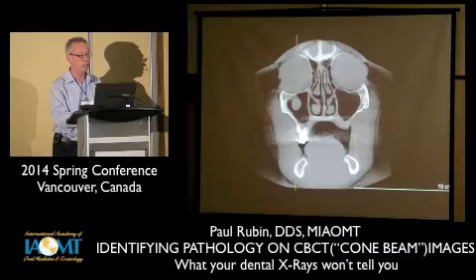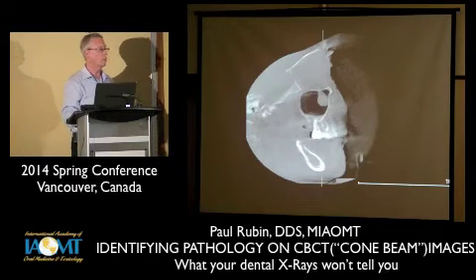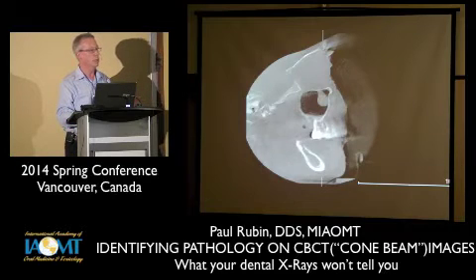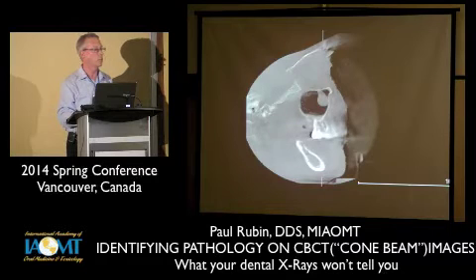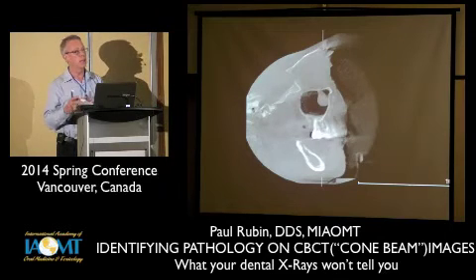Here's that same sinus polyp on the 2 other views, the coronal view and the sagittal view. And on this software, you can capture this screenshot, email this off to an ENT doctor with a report, and have them have that information. You can also take the entire image onto a disk and mail that.